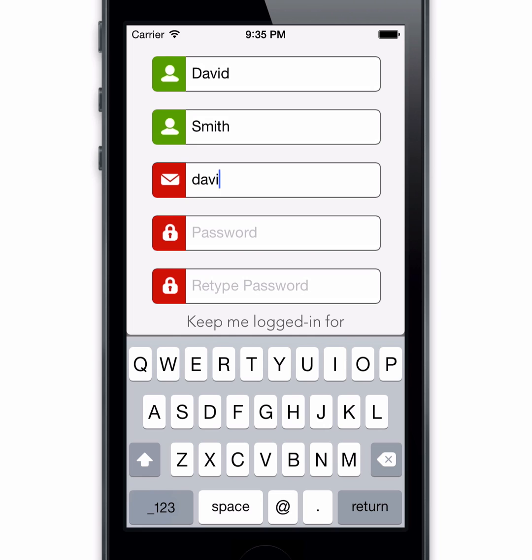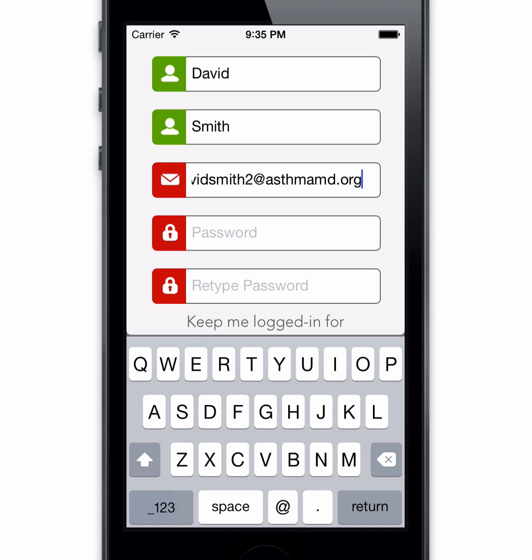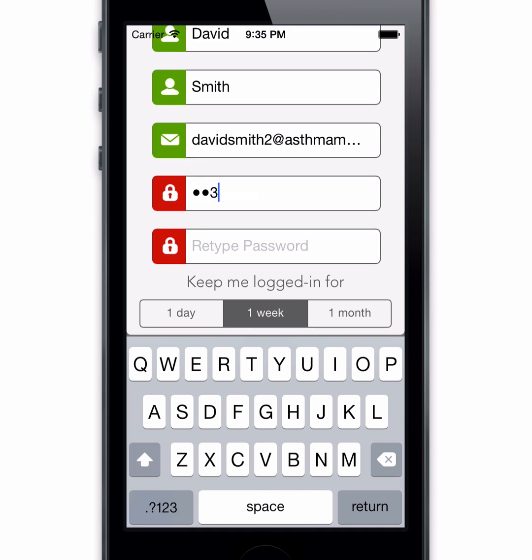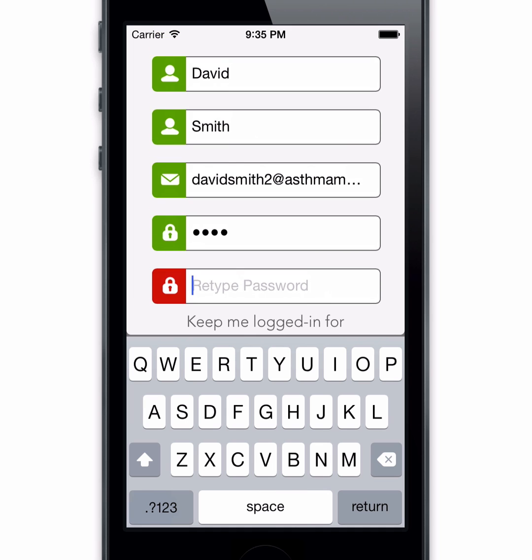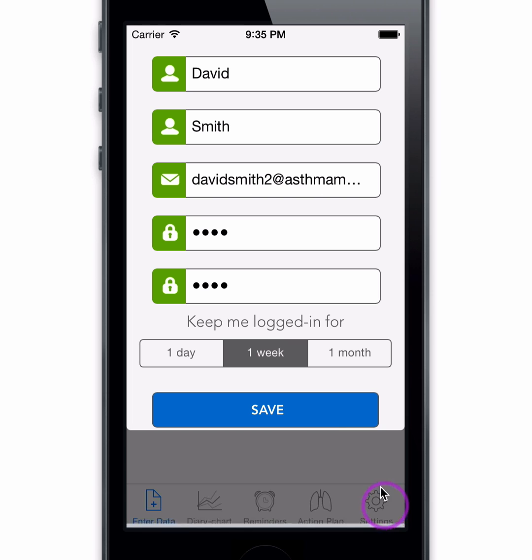AsthmaMD 3.0 securely stores your asthma diary encrypted on a cloud, accessible from multiple devices. Take extra care to remember your password, as retrieving your asthma diary would not be possible without it.